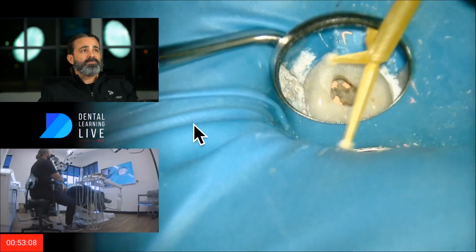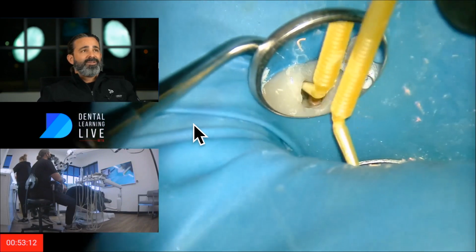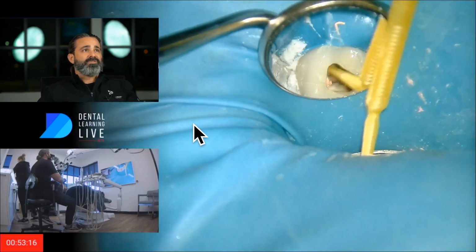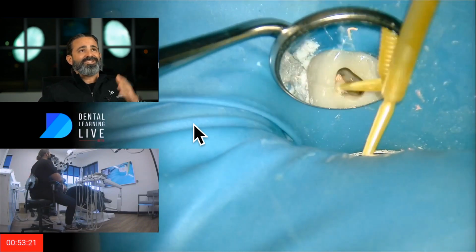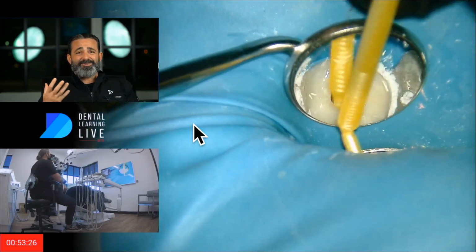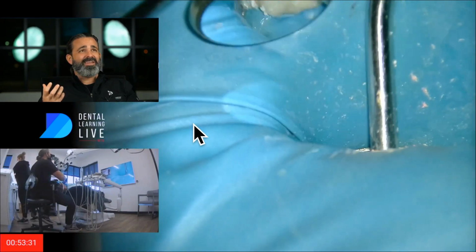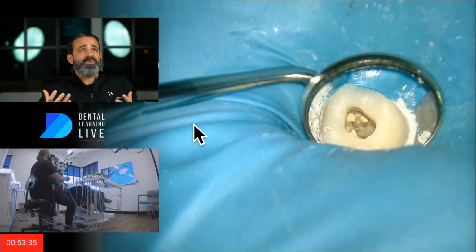Things looking clean. You know, there's always a joke, early on, I think we've all been there, when we've done a traditional pre-GentleWave sort of retreatment. You feel good about everything, and you get to this step, and your assistant comes by and blows air. And then all of a sudden you smell that necrotic odor again, and you're like, what in the heck did I just do for the last hour of my life? Why do I still have that smell?